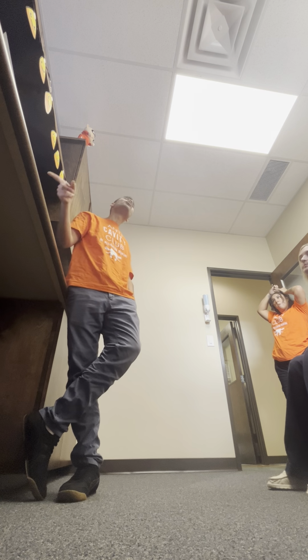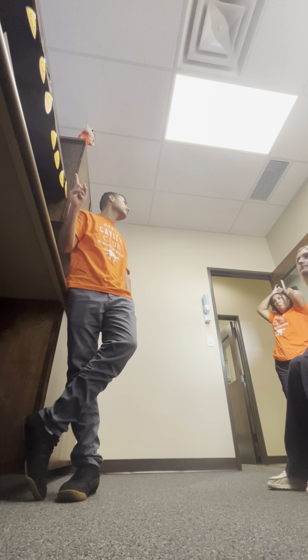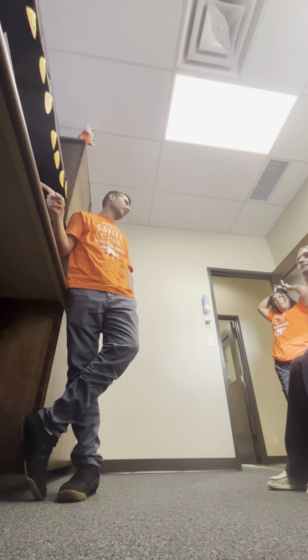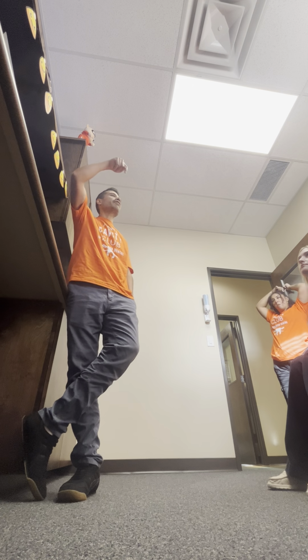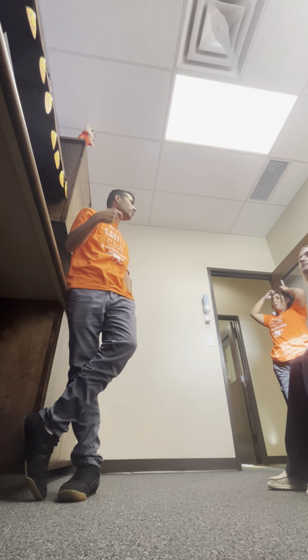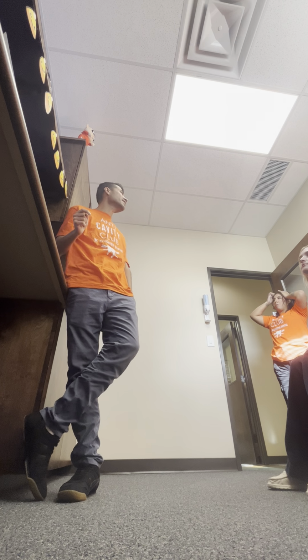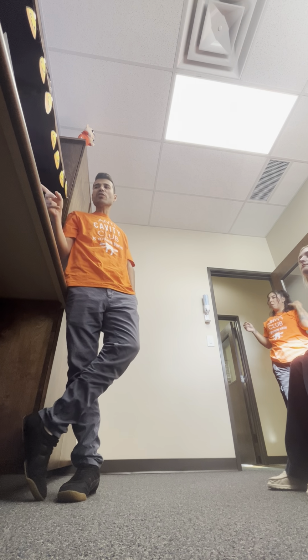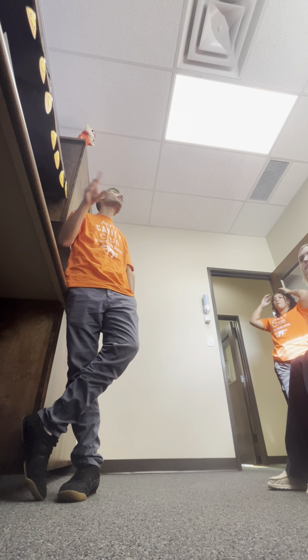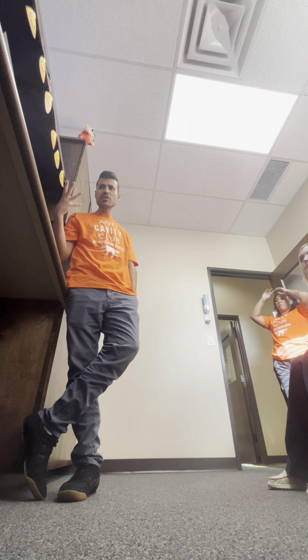I myself don't do it at all here, because most of the kids that we treat have really bad hygiene, and this kind of space maintainer goes literally from the gum all the way to the bone. So if they have bad hygiene and they're not brushing well, they can get infected pretty easily. Most of the time it's not a good treatment for the kids that we see, but it's always good to see.